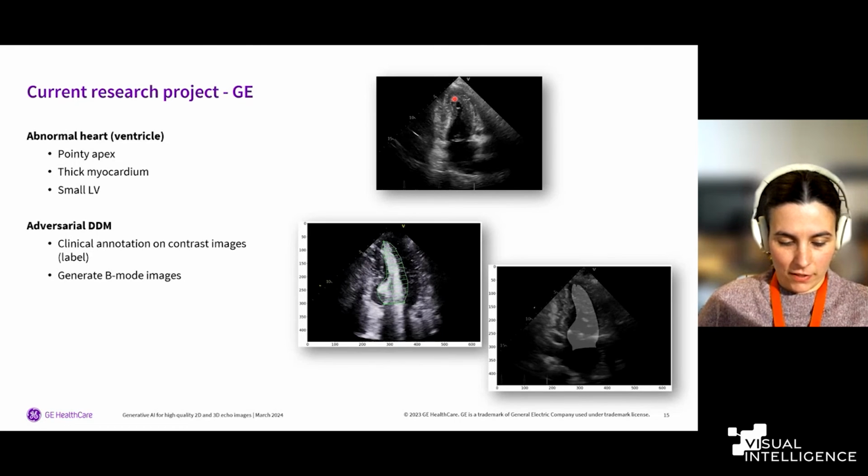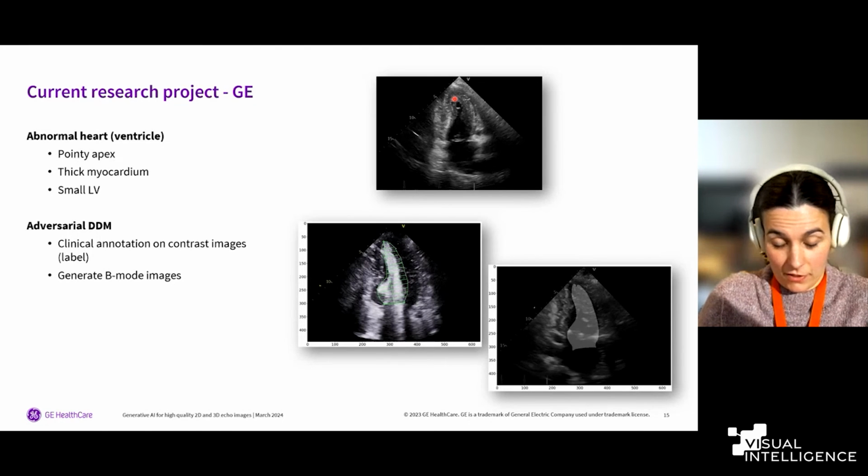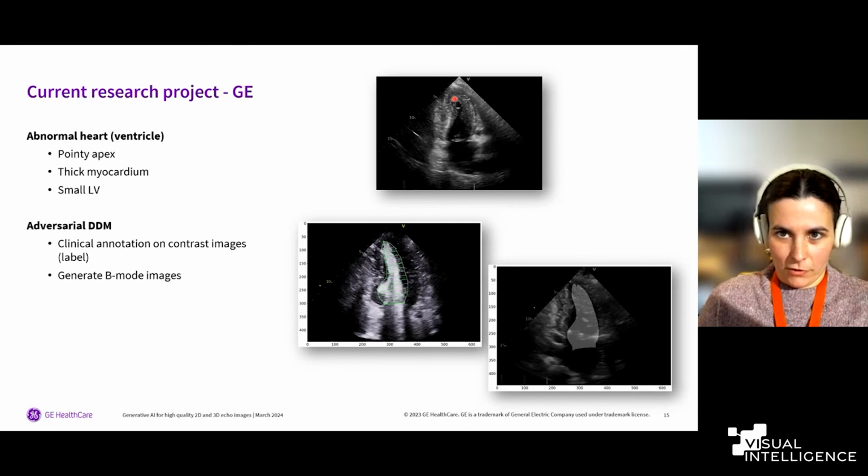So what happens is that the current AI models that are out there fail when they face such a patient. The current AI algorithms on the market did not have enough of these pathological cases used to train those models.